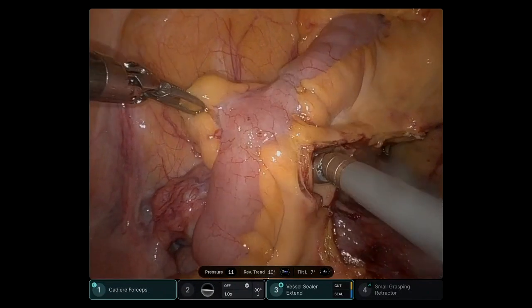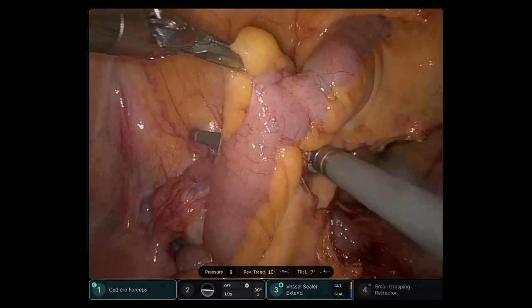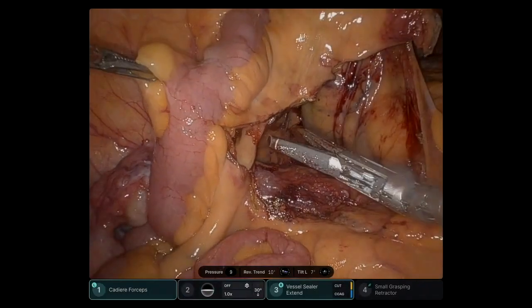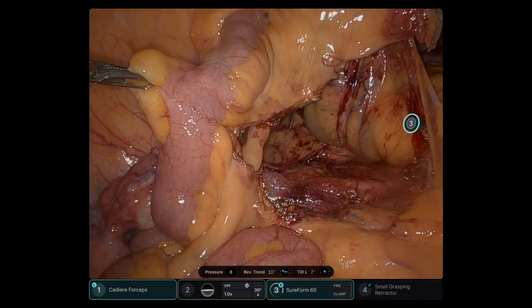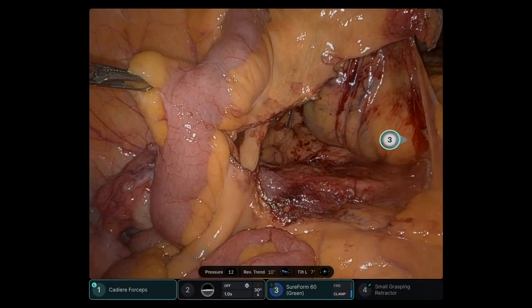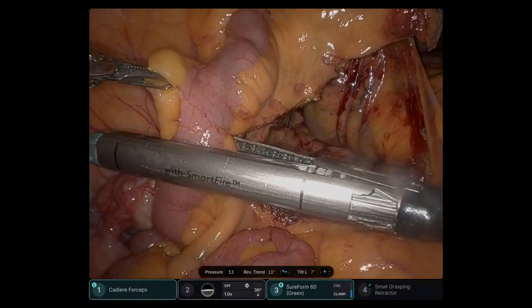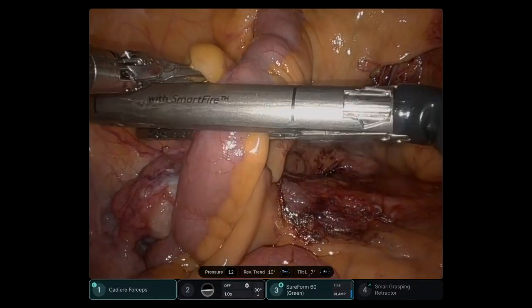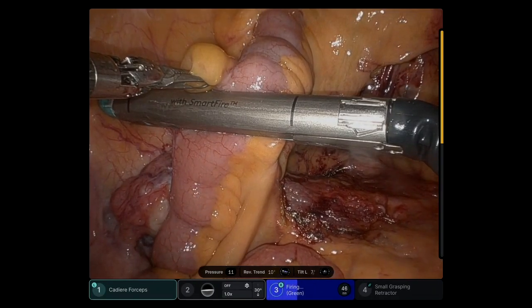The vessel sealer is the same as the XI — the speed is also the same. There is not much difference on that instrument. As with the XI, you can switch to ICG green from the console as well. Here I'm inserting a green load stapler and the transection is performed.